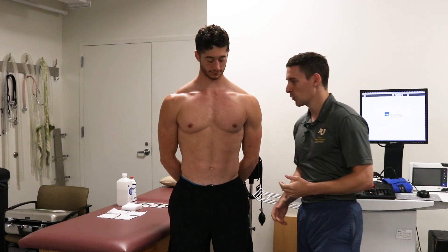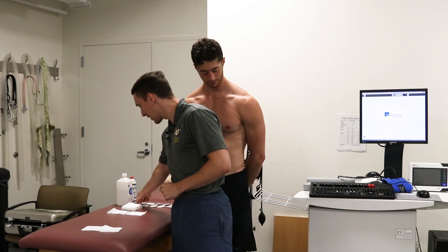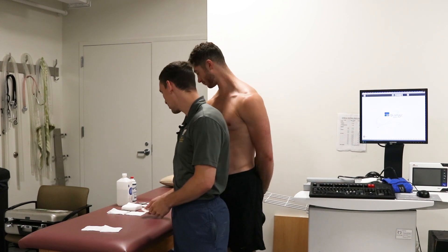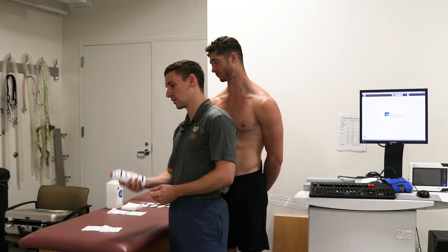The things we're going to need today: we've got our gauze, clean gauze, 10 EKG electrodes, some rubbing alcohol, and our ultrasound gel to help with conductivity.